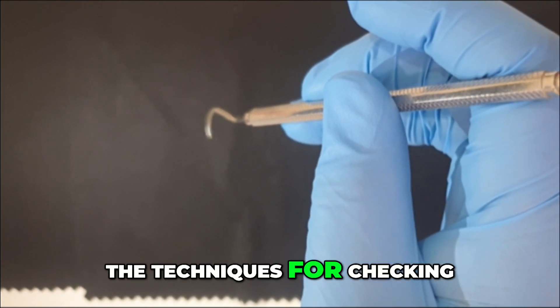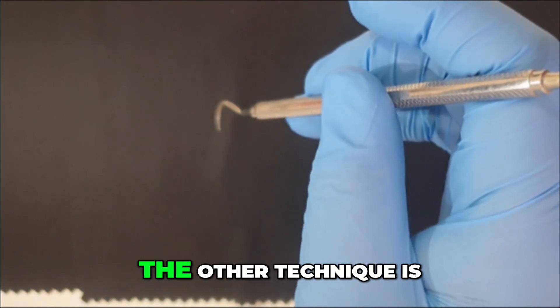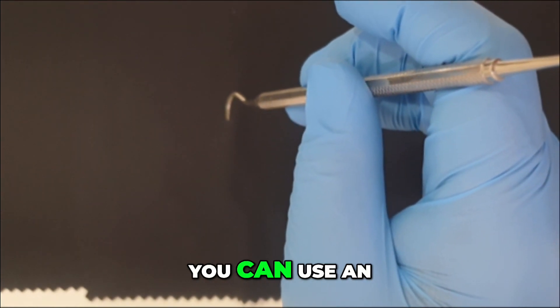This is one of the techniques for checking the sharpness of the instrument. The other technique is, you can use an acrylic stick.